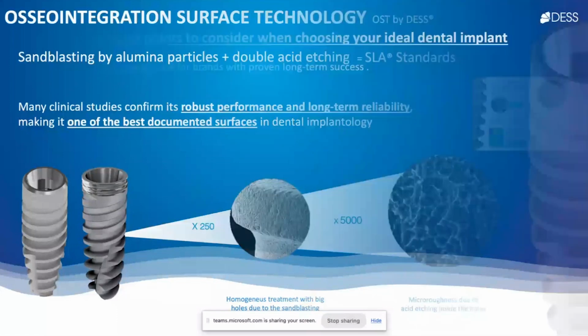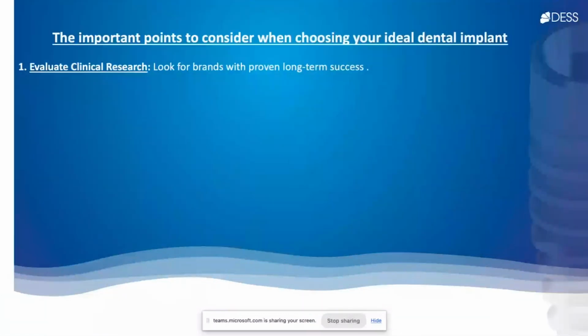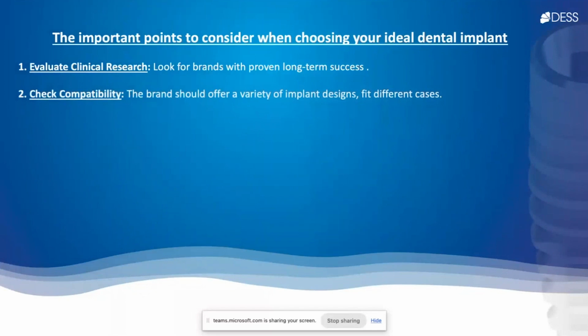So I go through some biology and what the factors are that can affect osseointegration. We have to know how to choose our implant, or any other dental implant. When you choose your implant, you have to make sure that the company you are dealing with provides clinical research. You have to check the compatibility.